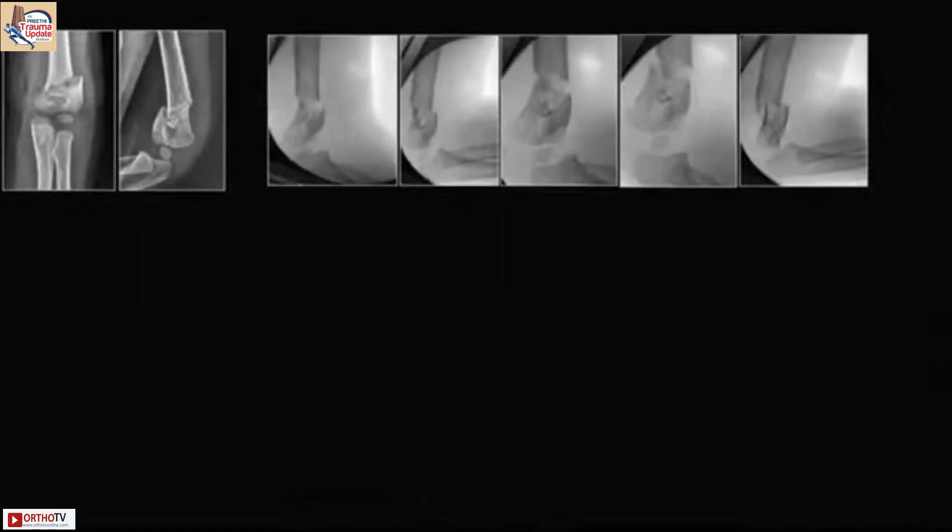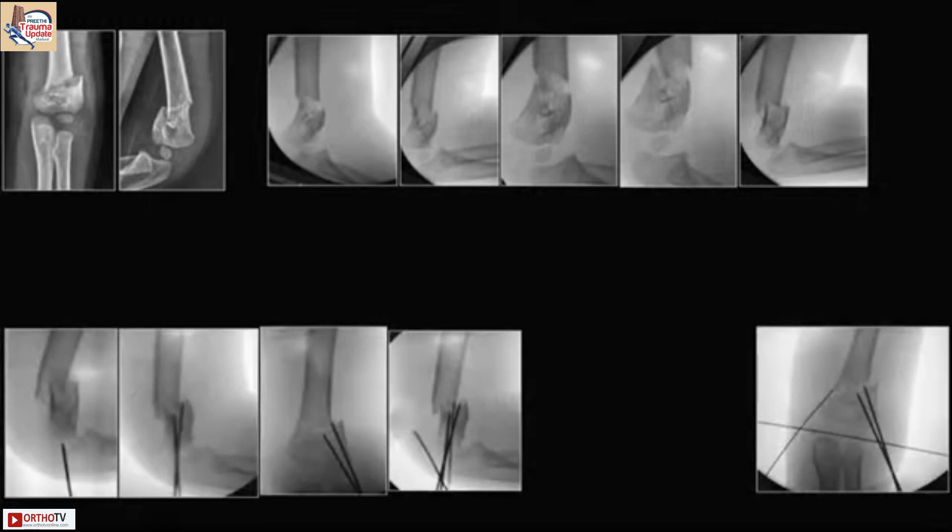This is another example of a transverse-oblique fracture that was going into both flexion and extension — it was highly unstable. So we used a joystick technique through the distal fragment.